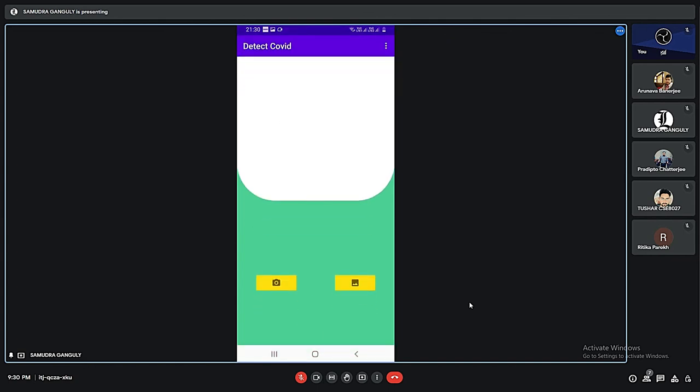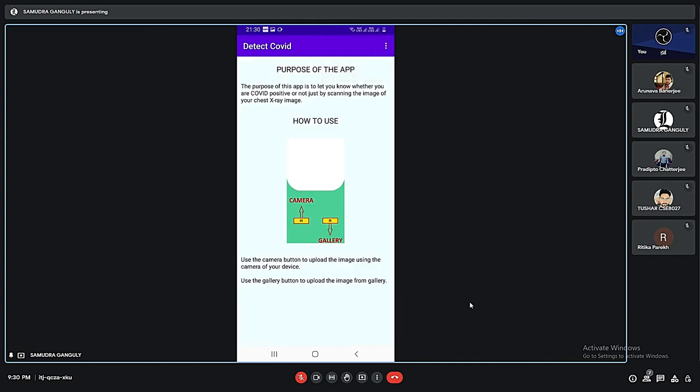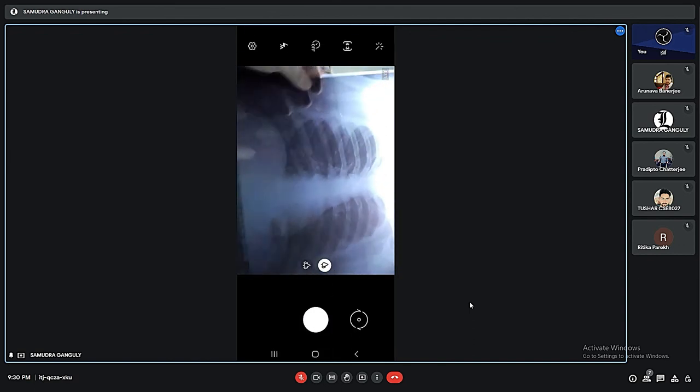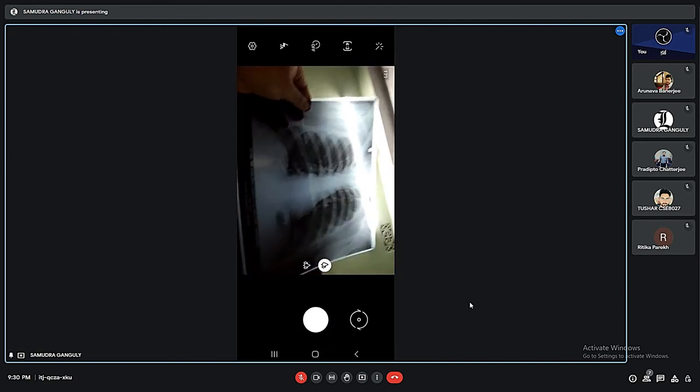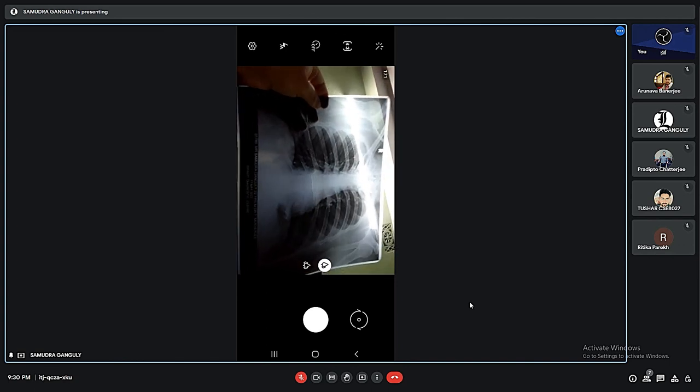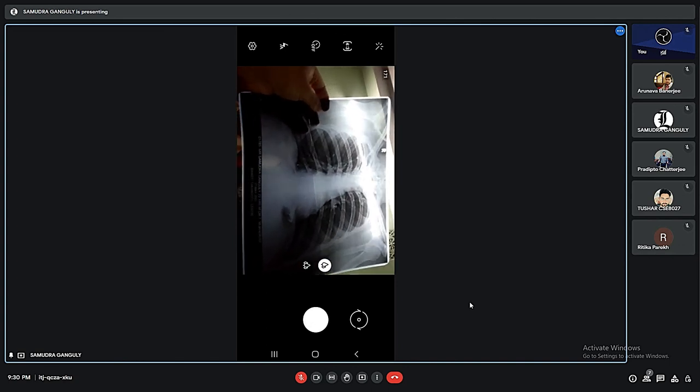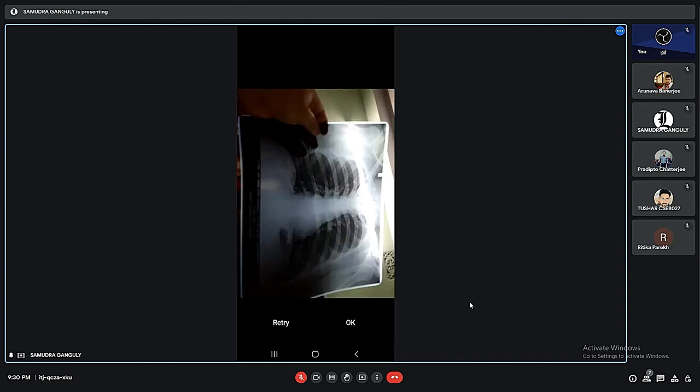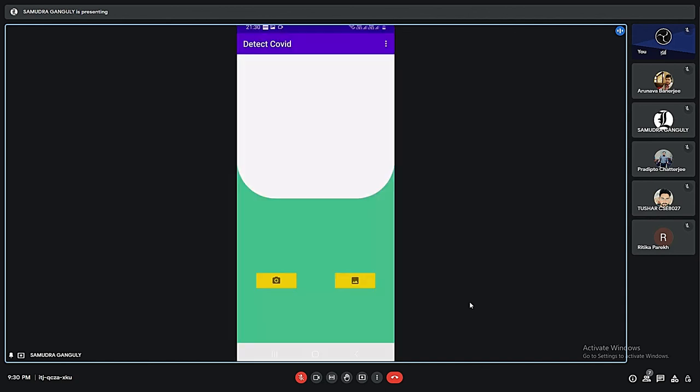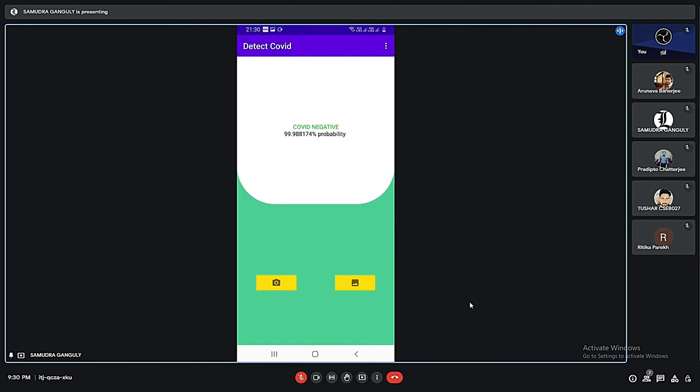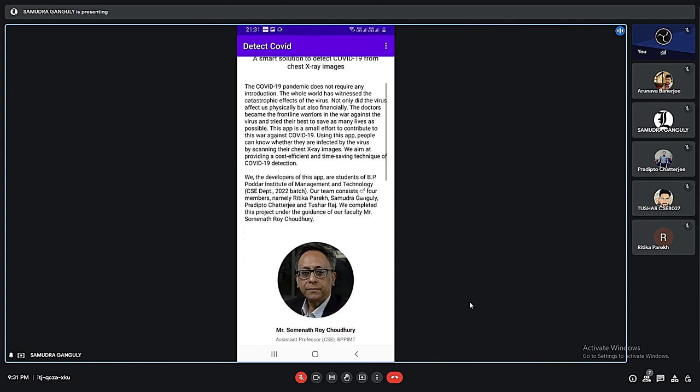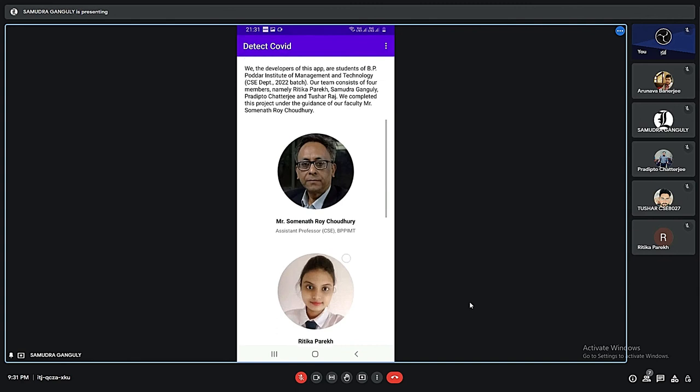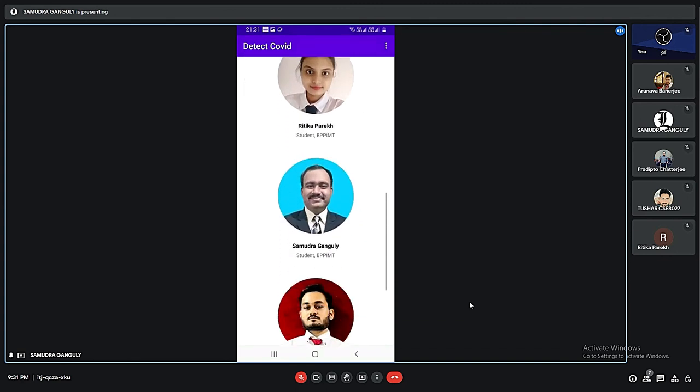We've got two buttons. One is for uploading with the help of camera and the other one is for uploading from the gallery. We also have the instructions for using this app. We have the camera button and the gallery button. Following these instructions, we can upload any picture. Let me show you by uploading my own X-ray. Here I am clicking on the camera button. This is my chest X-ray. Let me click a photo. It shows COVID negative with the probability of 99.98 percent. We also have the about section of our app where we have written some of our purpose of creating this app along with our team members and our mentor.